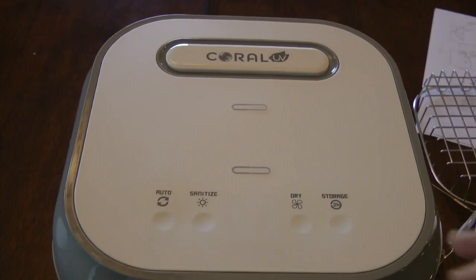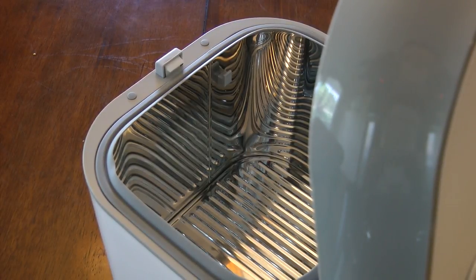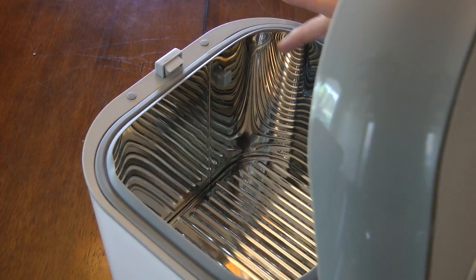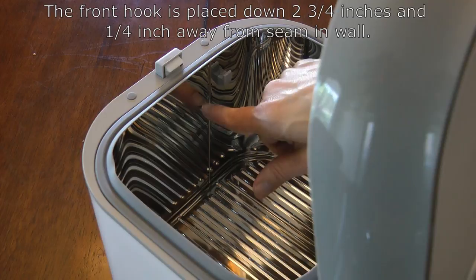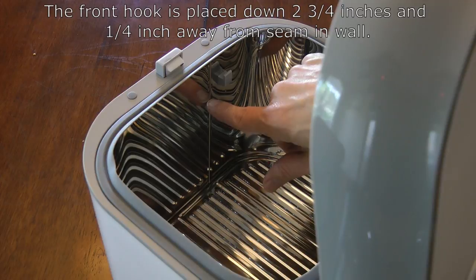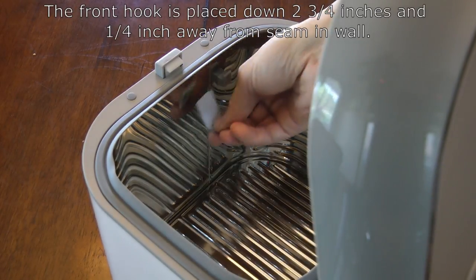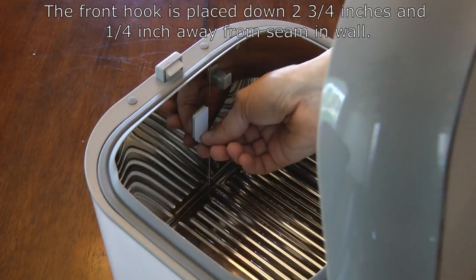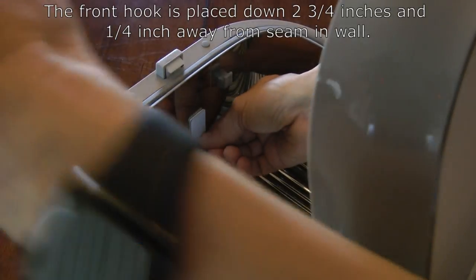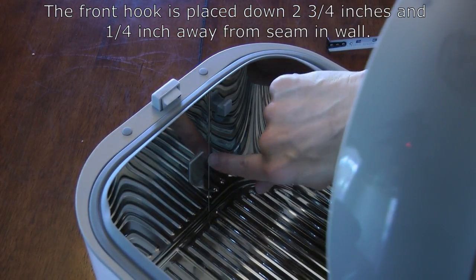Now let's look at the front hook. Turning the unit around to see the front wall: there's already one plastic hook here to support the basket normally, and a seam that runs all the way down the front of the chamber. We're going to place our hook to one side of that seam with a one quarter inch gap between our hook and the seam. The hook is placed two and three quarter inches down from the metal top of the chamber, and one quarter inch away from the seam. I've gone ahead and mounted that hook roughly a quarter inch away from the seam.